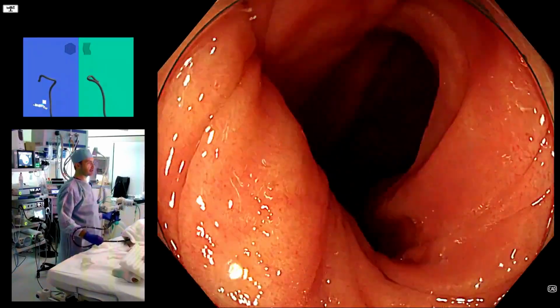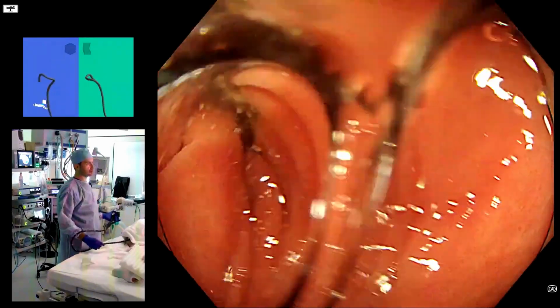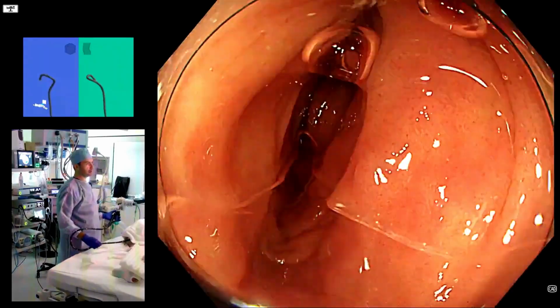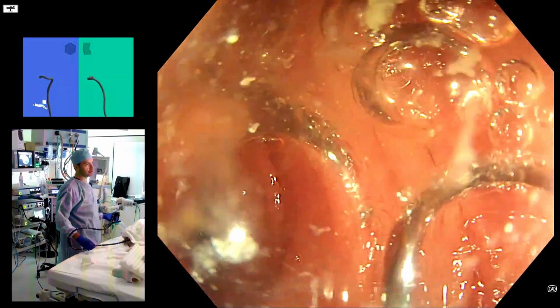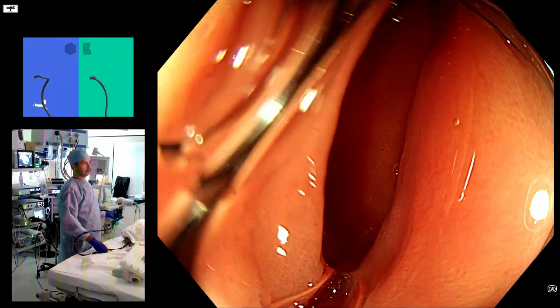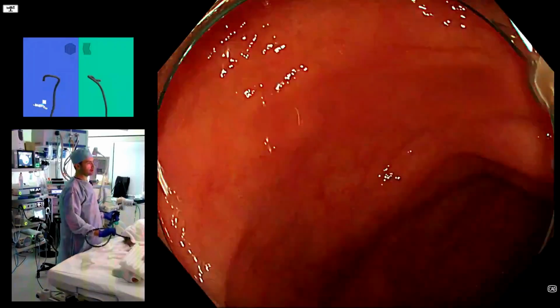We haven't got much distension. Maybe it's a little bit of a difficult procedure. We've seen a few things, but maybe we just think that they're nothing. And the point of this is to say, well, look, maybe there's a lot of pathology here, but you just can't see it unless you show it to AI. So AI is great, but AI is not great if you don't show the pathology to the AI, right?